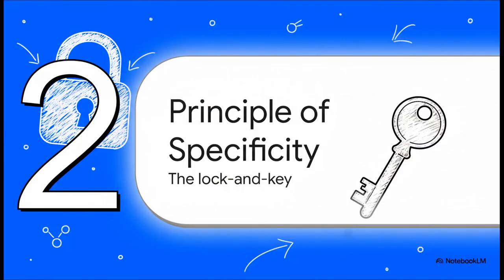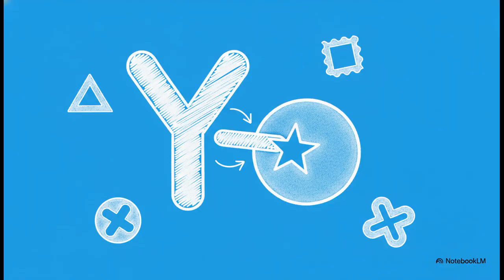So, the big question is, how does IHC achieve this incredible precision? Well, it all boils down to a fundamental biological principle: specificity. The whole technique is really built on a beautiful biological concept, the lock and key model. We're using the natural ability of an antibody to find and bind to its one specific target, a protein we call an antigen. You can think of the antibody as a perfectly cut key, designed to fit only one specific molecular lock out of the thousands inside a cell.